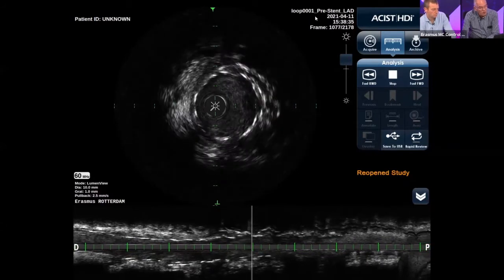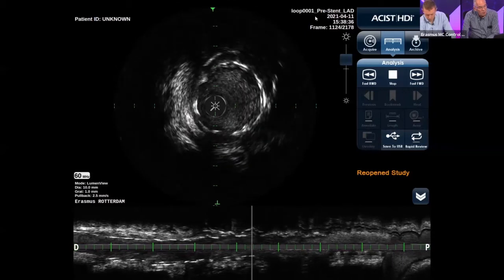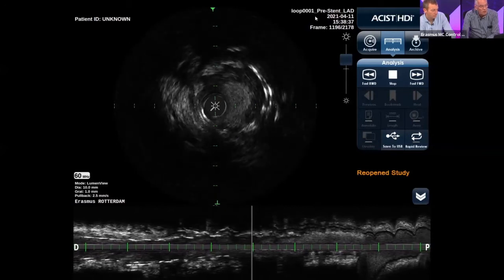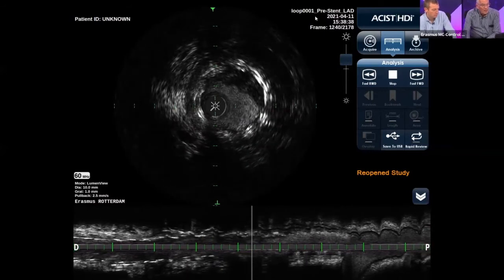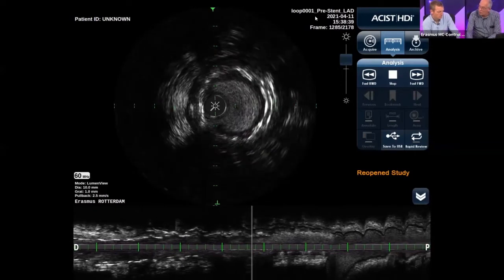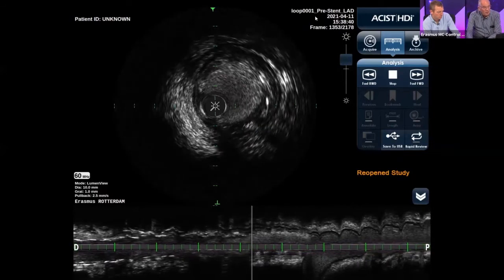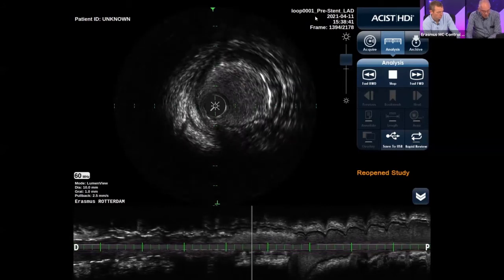We appreciate the lumen. On the side, you can now appreciate the black spots. Here at 1 o'clock, a huge mass of thrombus. So we call this late stent thrombosis because this thrombus has been there for some time, partly occluding the vessel, and then at a certain moment it was completely occluding.